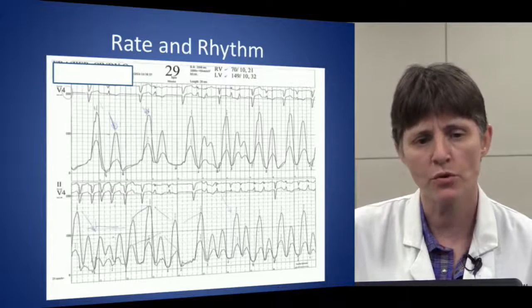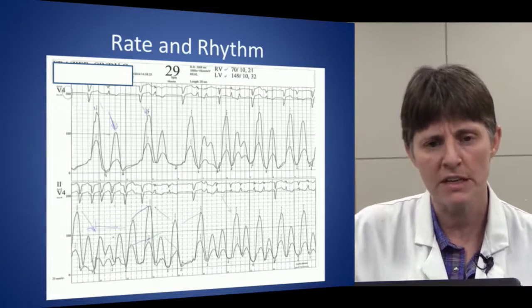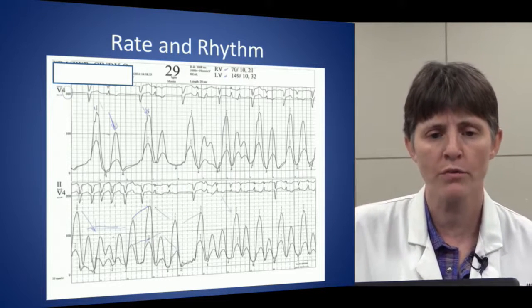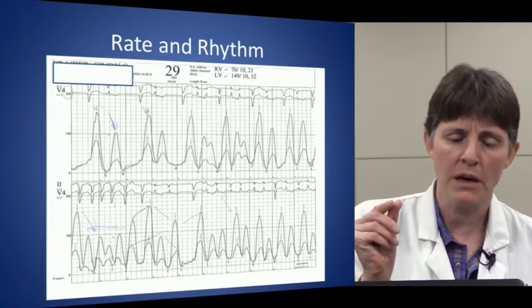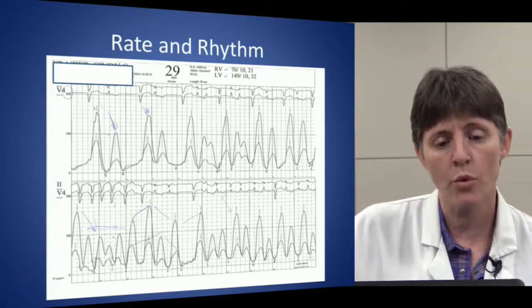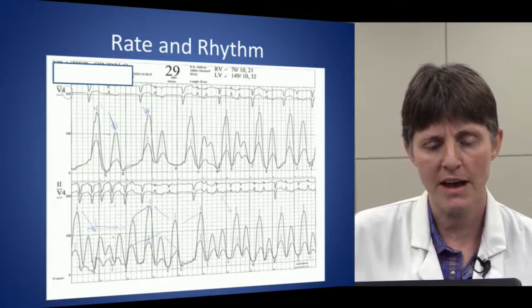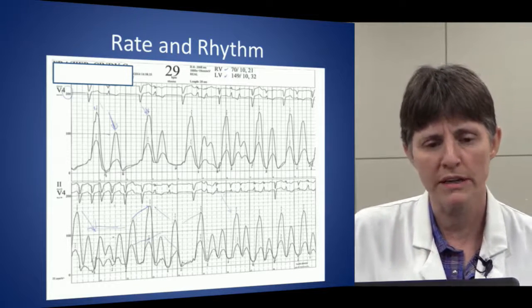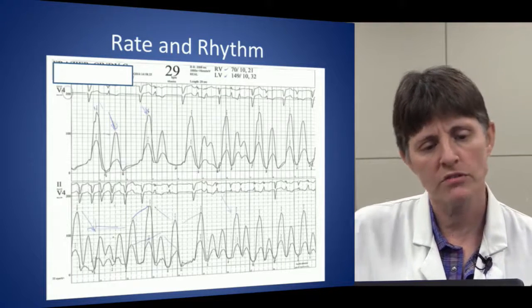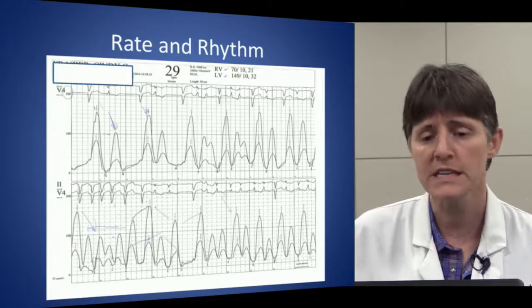The next tracing shows us similar things. So here we have a beat, and then we have an early beat or PVC, and then there's a delay. After the delay, the tracings are higher because there's more filling time and more pressure. If the beat comes too quickly, there's not enough filling time, so the second beat is much lower in terms of pressure. On the bottom tracing, you can see that the heart rate gets very fast at times, and when that happens, blood pressure is very low. So if that were your left ventricular pressure on the screen, you could see that the person's blood pressure could be very low with persistent tachycardia or with VT or something like that.